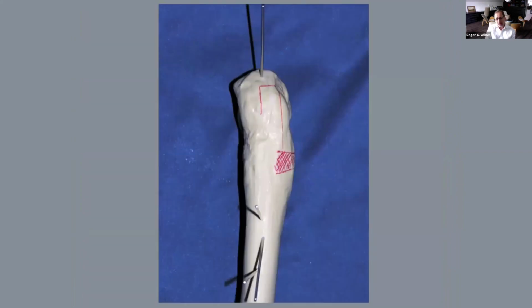This is what you're really going to be looking at in the operating room, right? It's really just the lateral cortex of the femur. And I do sometimes trace out where the plate is going to sit on the lateral cortex, because occasionally you may want to flex or extend it a little bit, depending on how much deformity you have in it. In this case, I wanted to flex the femur just a little bit because I felt that there was a little bit of an extension deformity to it.